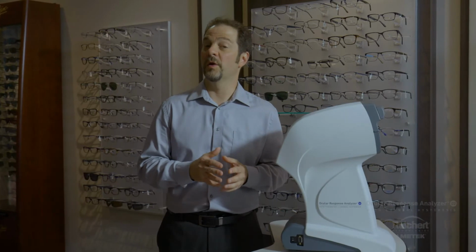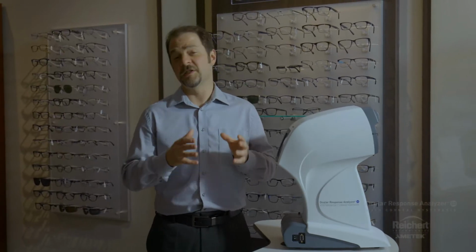And also, no two tonometers are affected by the cornea in the same way, and there's instances such as corneal edema, as an example, where the Goldmann tonometer is going to significantly underestimate the pressure, and our IOP-G measurement just doesn't behave in the same manner. So, if you're seeing differences between IOP-G and Goldmann tonometry in some patients, even if it's a large disagreement on occasion, that should be considered normal.